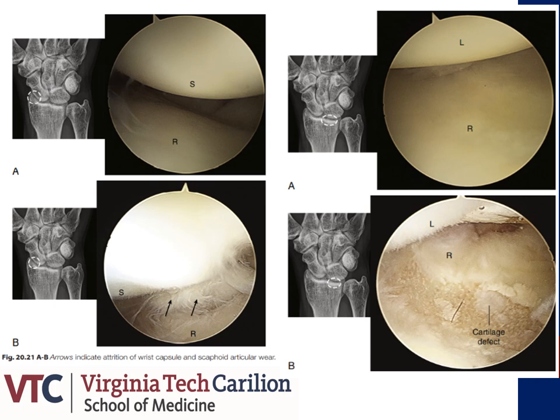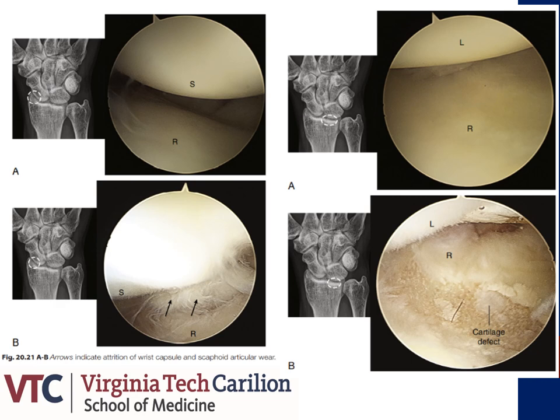These pictures on the left show two views of different patients through the 3-4 portal and on the right, two views from the 4-5 portal. The top images demonstrate a normal appearance of the articular cartilage between the scaphoid and radius and the lunate and radius respectively, while the lower photos demonstrate different levels of osteoarthritic changes that can be encountered.